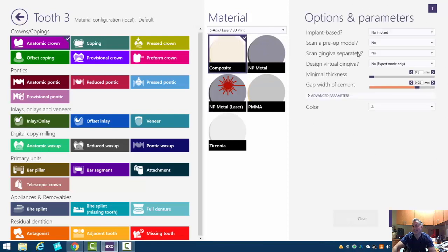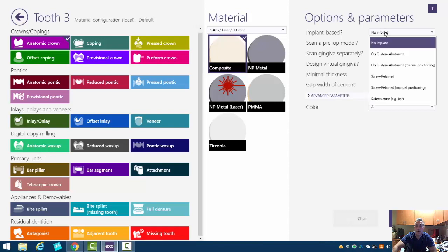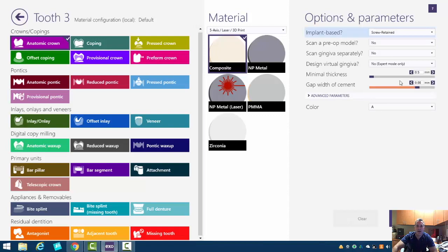Over here on the right, it's going to ask you, do you want it implant based? So this is the same button I would use to make a temporary crown on a prep. So we're going to go ahead and select here. Yes, we want a screw retaining crown.